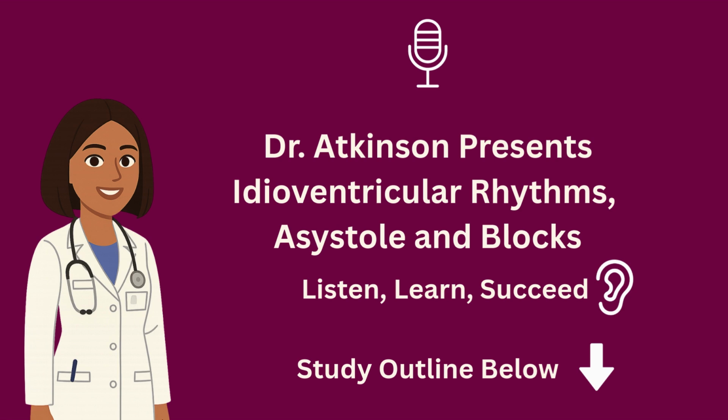Second-degree AV block type 1, or Wenckebach, is easy to spot once you know the pattern. With each beat, the PR interval gets a little longer until eventually a QRS complex is dropped. Then the cycle begins again. Many patients tolerate this without symptoms, but frequent episodes can cause palpitations or lightheadedness.